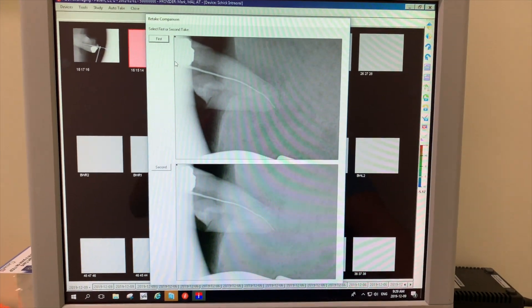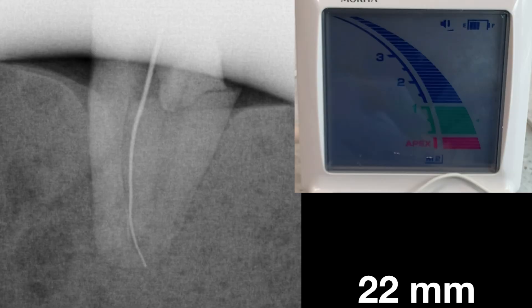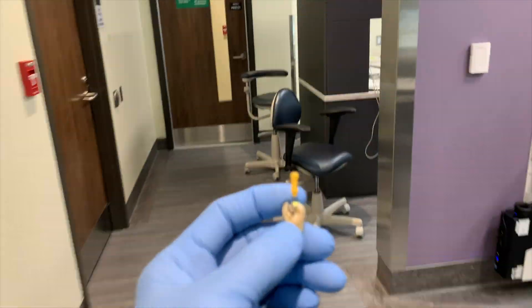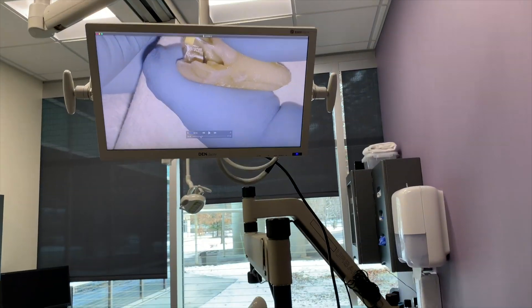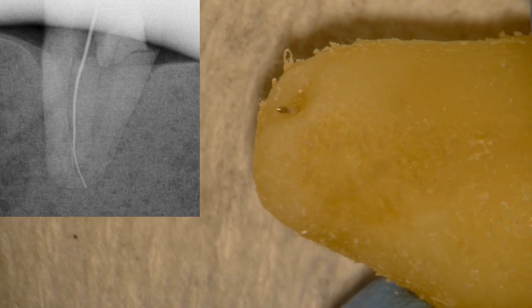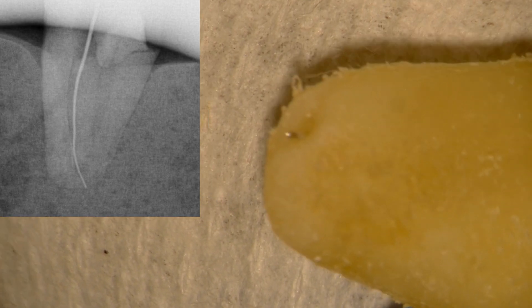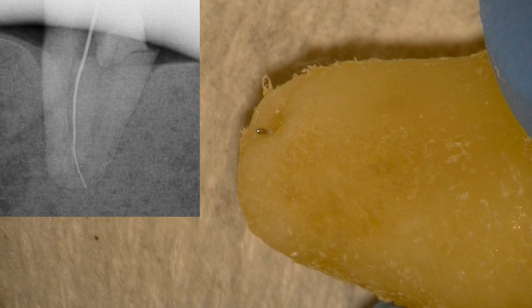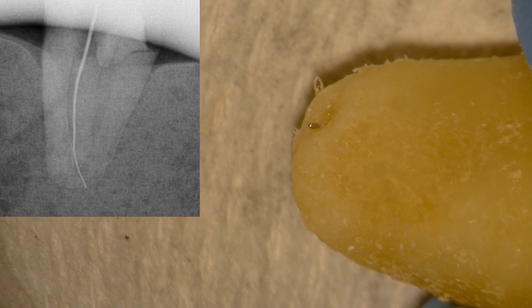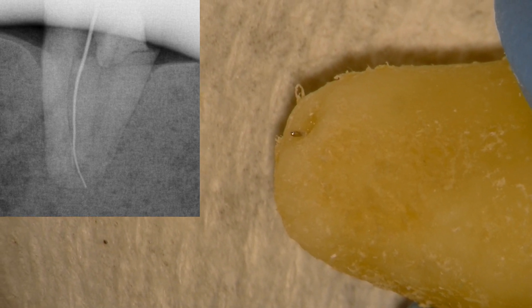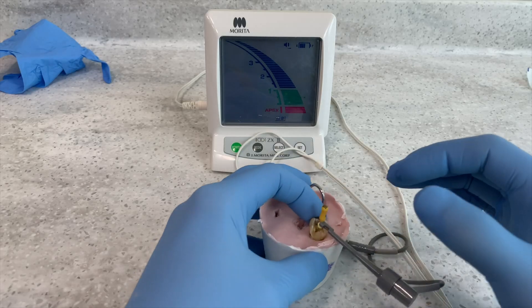Let's take a look at this. So at four red bars, essentially the file is at the radiographic apex. Let's take a look at this under the microscope. So under the magnification at roughly 12 times, you can see the number 20 file and how it relates to the radiograph on the left. And the image you see on the right — remember, this is a 20 file — compare that size to the major foramen.